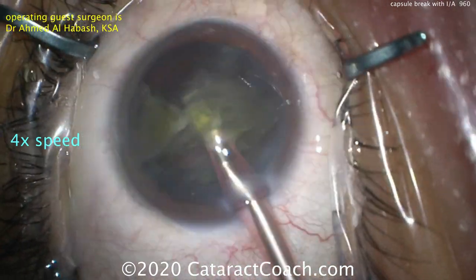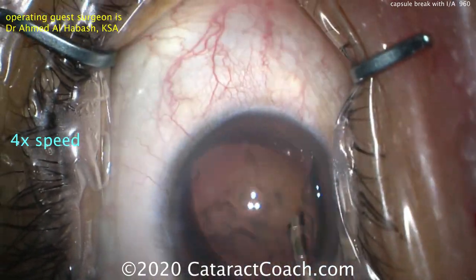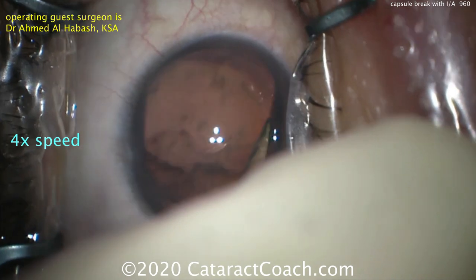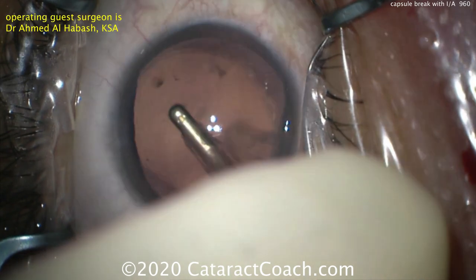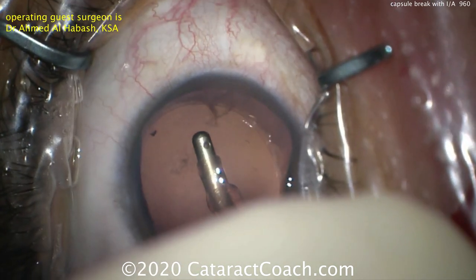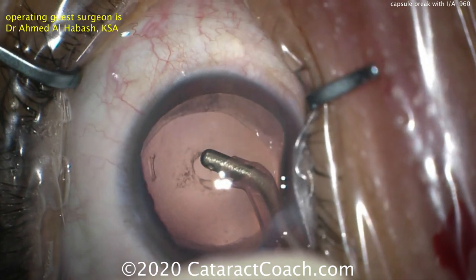The nucleus is removed without any issues at all. In these posterior polar cases, we can have an absent, weak, or very fragile central posterior capsule — that's the nature of the posterior polar cataract. Now during cortex removal, all the cortex is removed quite nicely, but when it goes to remove the central opacity, the posterior capsule breaks right where the posterior polar opacity is. There's the break.